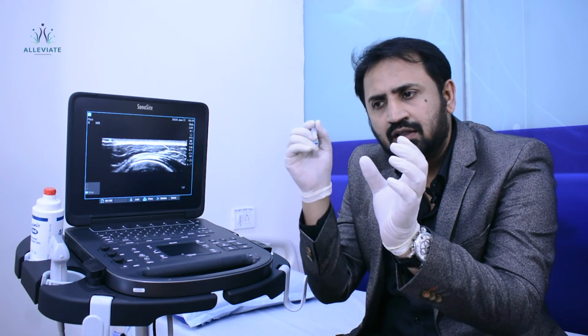One more thing which we can do with ultrasound is a suprascapular nerve block. The suprascapular nerve passes on the top. So we hold back and we can go in plane and deposit close to 5 ml in the fossa so that we block the nerve and the patient has pain relief, and it can be helpful for the patient to mobilize or do exercises.